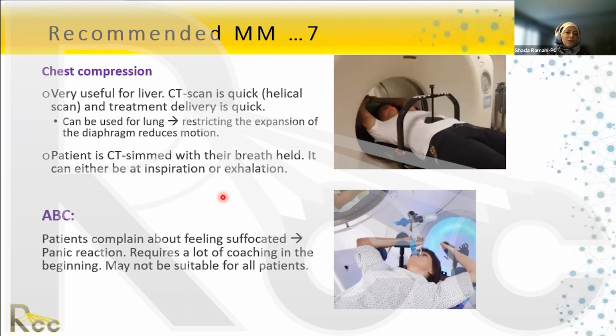Those two doctors want us to do a motion study to verify that with the chest compression we're seeing a motion of 5 millimeters or less. They want to see with their own eyes. They want us to submit numbers. Again, that's a school of thought. Other physicians would just go with chest compression and not bother with anything else.